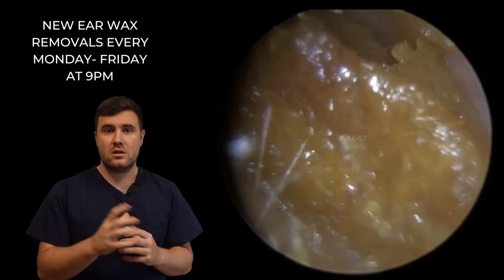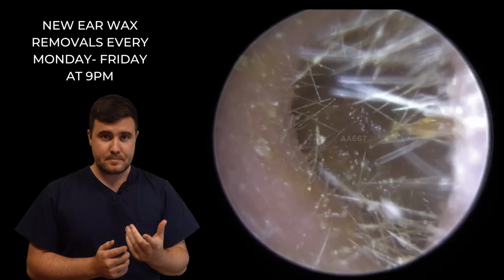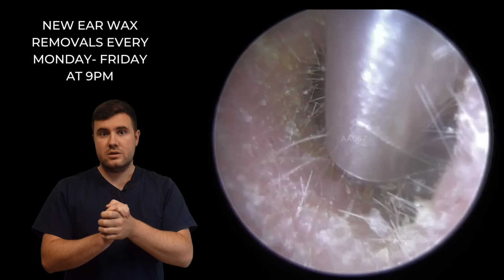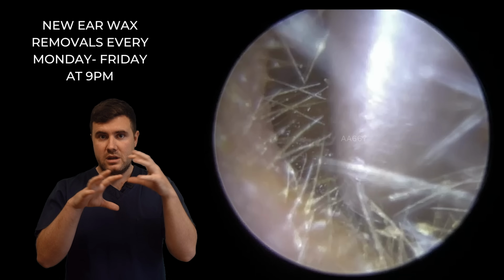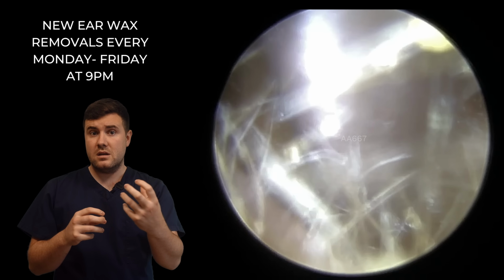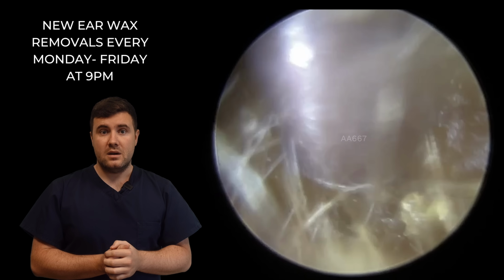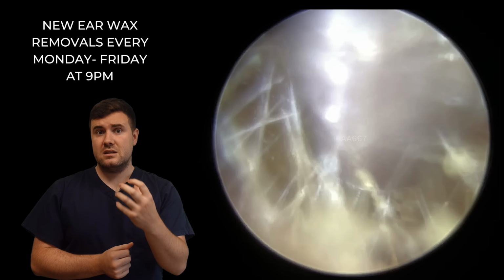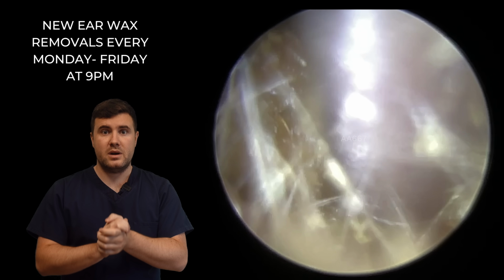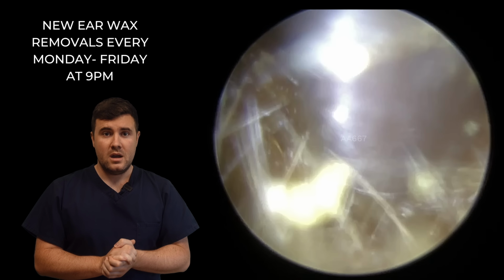Right, so what we've got here, this patient's come through just having some difficulties in one ear. You can see just looking in here, right near the entrance, we've got a lot of dry, crumbly, sort of like dead skin, which can affect the rest of the wax in the ear. Now we're going in with the standard size Zollner tube here, just touching up different parts of this wax, just trying to get this to loosen away.